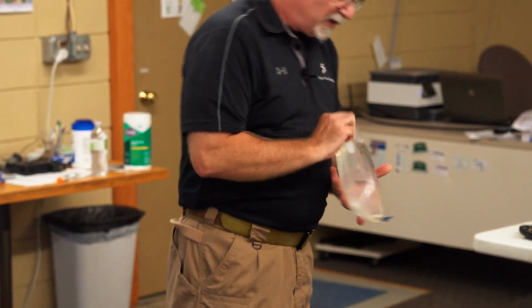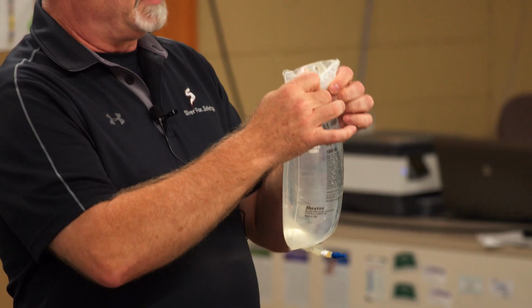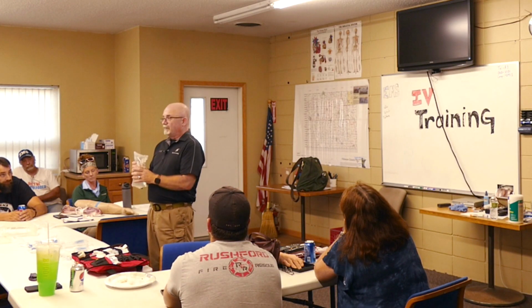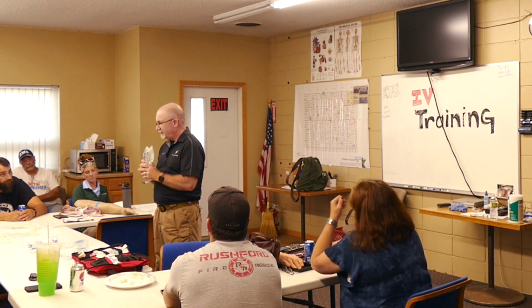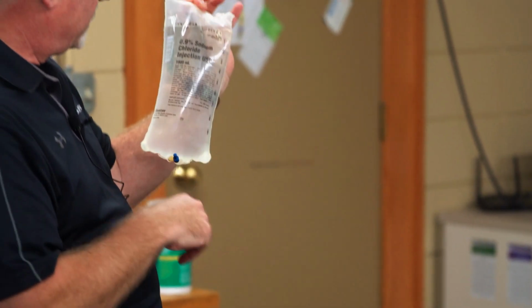All right, so we'll start back up at the top. Big one here: expiration date. This one's good through October of next year. You've got some good fresh stuff, I like it. For whatever reason, saline was really hard to get for a while, in 2014, and then during the pandemic it would be available and then it was gone. It's salt water, what the hell? How hard is it to make? But it's still a medication, theoretically.